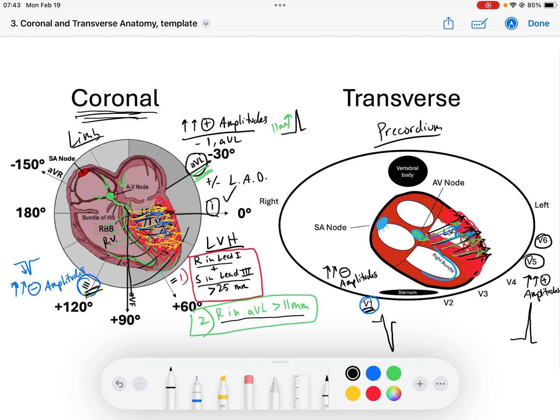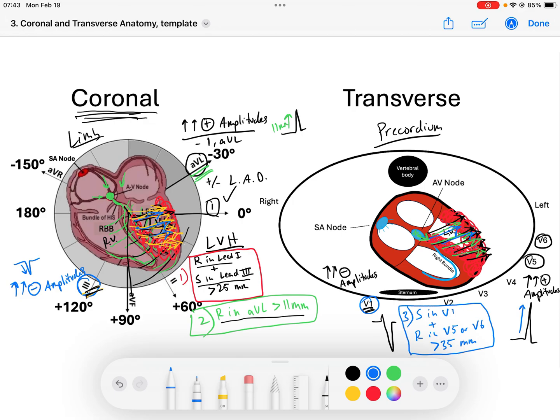A third criteria — one of the more common ones — is that if you take the amplitude of the S-wave in V1 and add it to whichever is taller between the R-wave in V5 or V6, and that sum is greater than 35 millimeters, then you have another criteria for left ventricular hypertrophy. The S-wave in V1 represents the negative forces going away toward the left ventricle, and the R-waves in the lateral leads measure the forces going toward them.